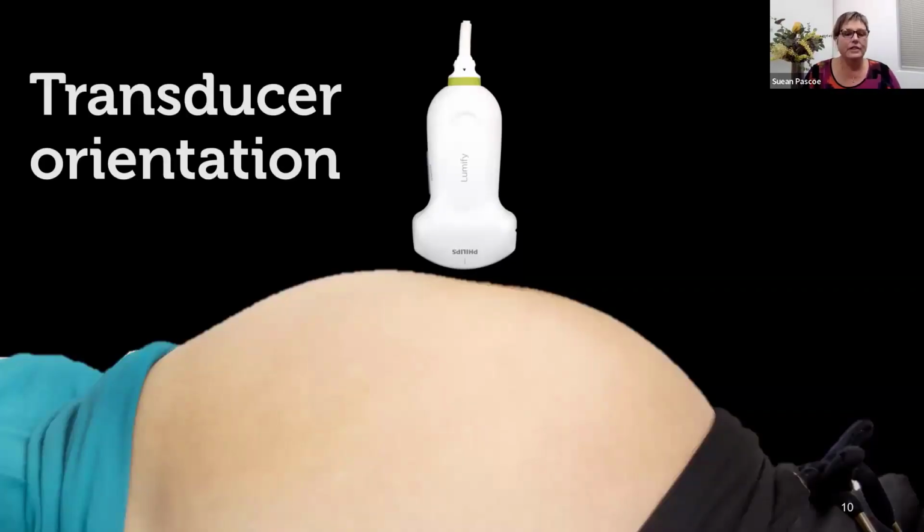Now, the trickier thing here, and the very important thing, is that you need to make sure that you stay perpendicular to the bed. You don't want to have too much probe angle on the transducer, because then you can artificially make these pockets bigger than they are. And so it's really important that when you're holding the probe on the abdomen, you keep your probe upright and vertical. We want to keep it perpendicular to the bed, and not tip our probe one way or the other, or even forwards and backwards, so that we're artificially enhancing how big that pocket is.